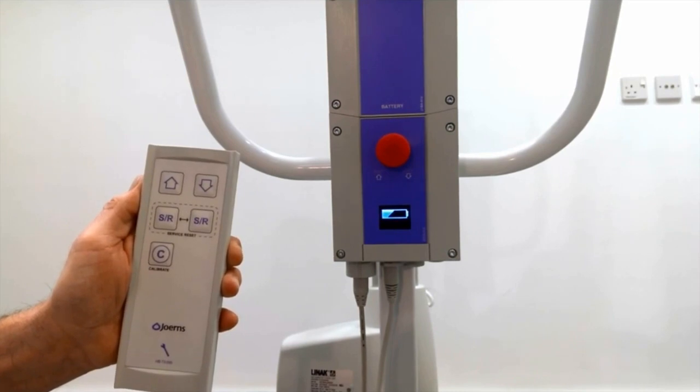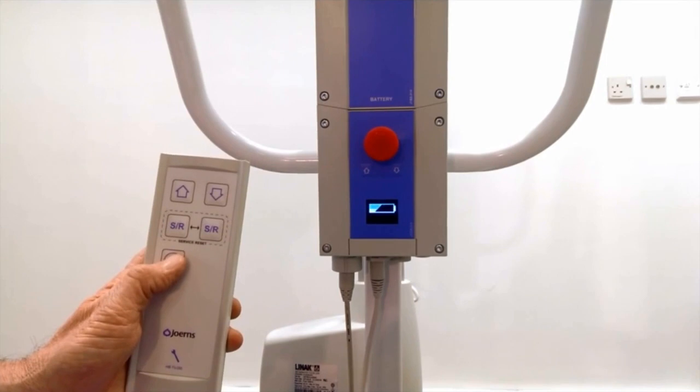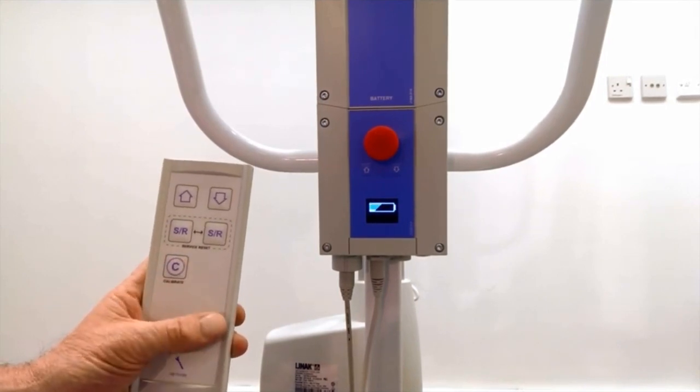In order to reset the lift overloads, simply press and hold the calibrate button for around 5 seconds until an audible beep is emitted.